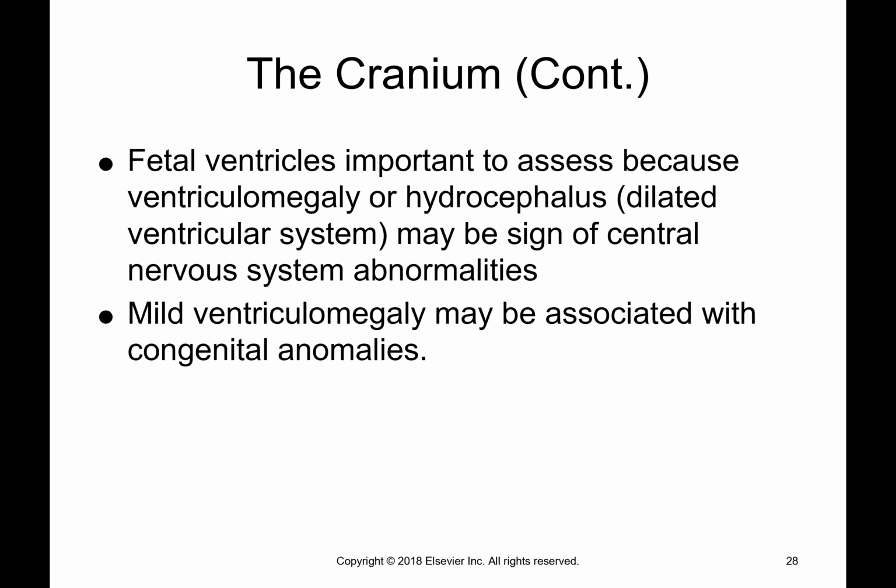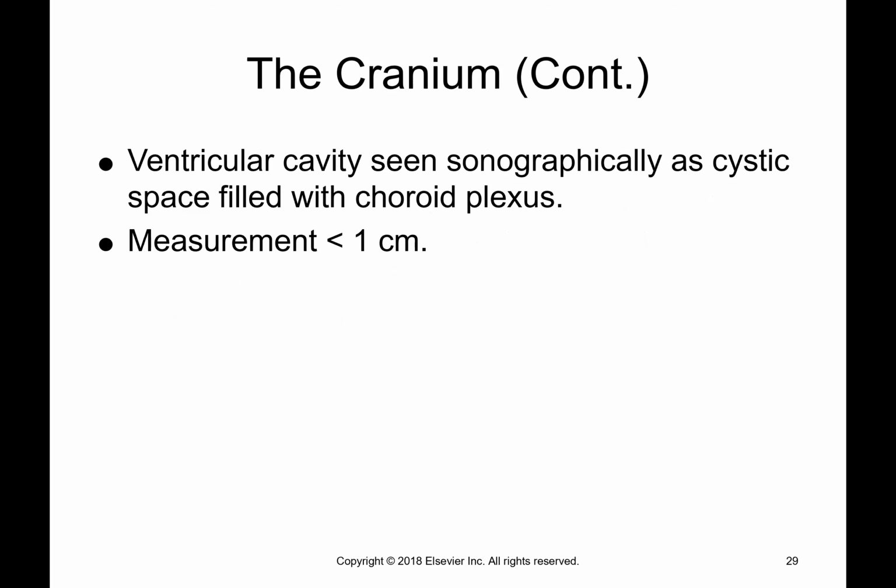Why are they important to assess? You can have what is called ventriculomegaly or hydrocephalus, which is a dilated ventricular system, if the measurement is greater than 10 millimeters. And that can mean that there could be a congenital anomaly going on. There could be a blockage somewhere in the ventricular system. And so it's important that we assess these. You want it less than 1 centimeter.